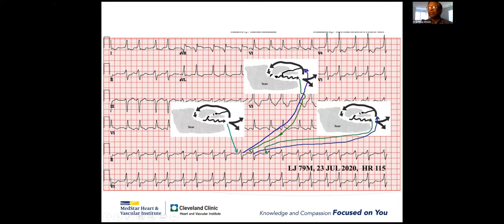But definitely that's a consideration because here it looks like a pre-excited beat. But all the QRS look similar. In WPW, Rafique bhai, typically antidromic conduction presenting with AFib and wide QRS, usually the rate is very high, like 190-200. This is a very slow VT. This patient had VT as slow as 100 beats per minute.